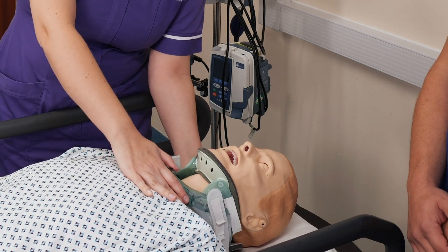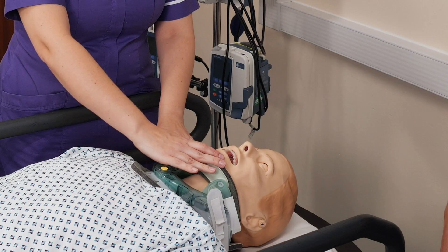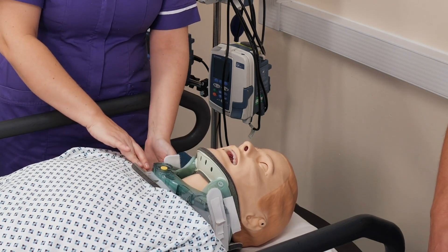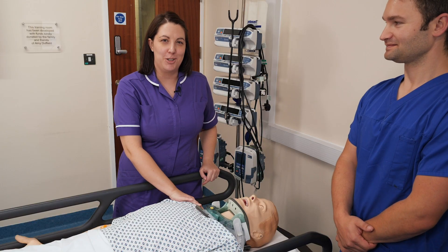You need to make sure that you have not got any plastic touching the patient's skin. There should always be a piece of foam, and that the foam is unkinked. When your patient's got the collar on, your main considerations are looking at the chin, making sure there's no pressure building up there, at the back of the head, and along the bottom edge. And that's how you fit a two-piece hard collar.